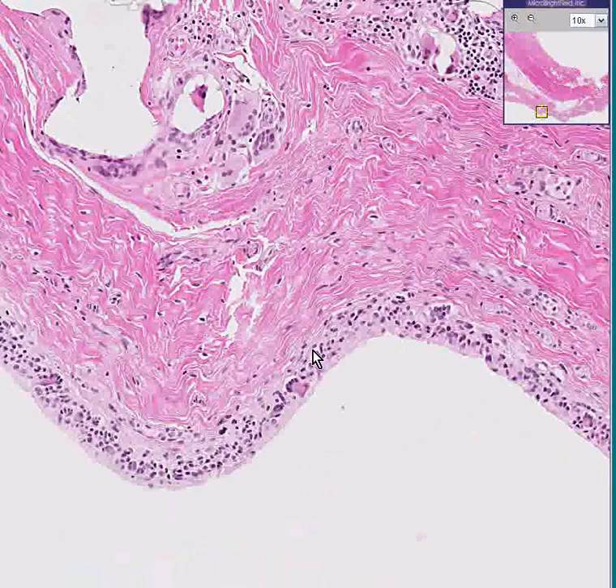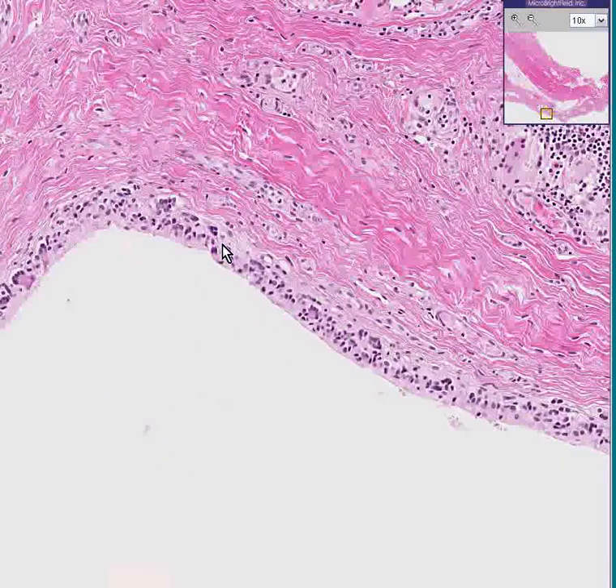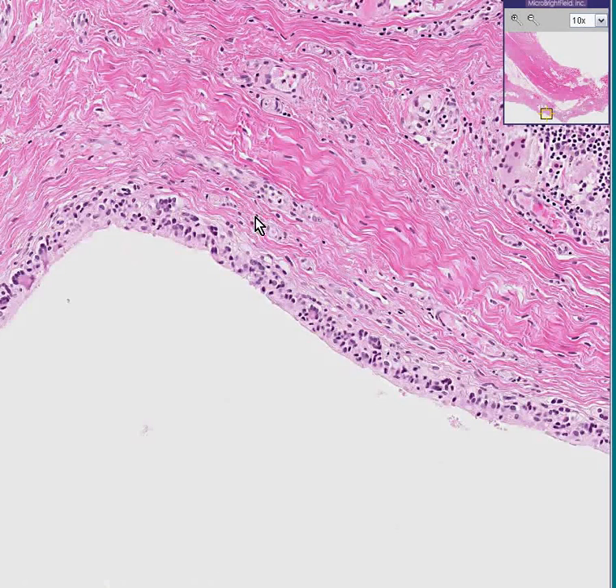Here is the edge of the fibrous tissue, and notice that there are foreign body giant cells in here as well. Here's another one. It could very well be that this was a part of the breast that was lying over perhaps a plastic bag of silicone.